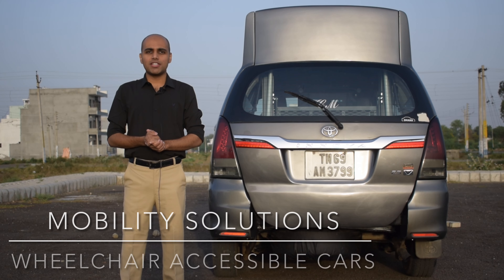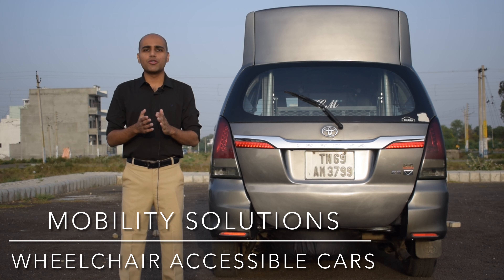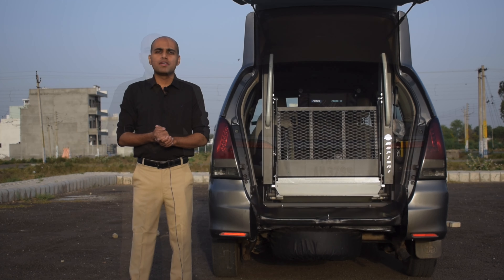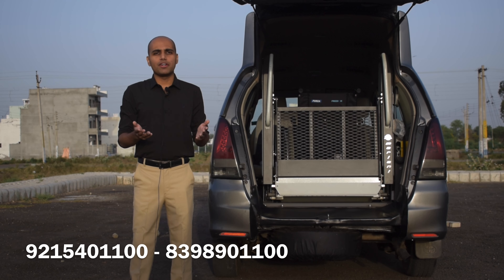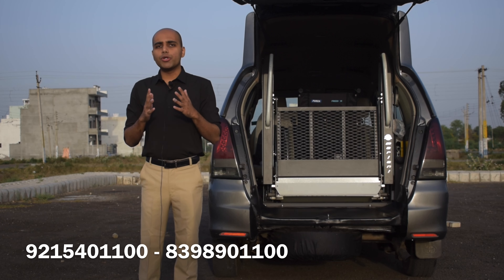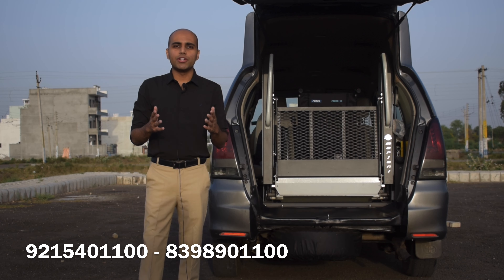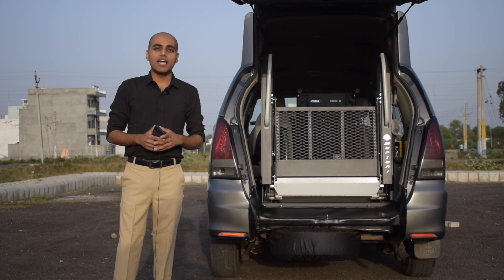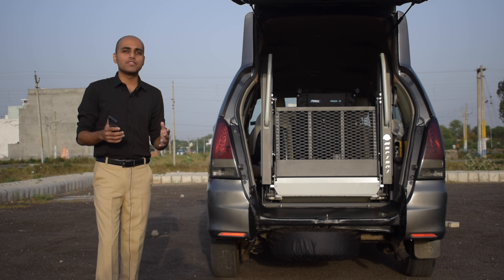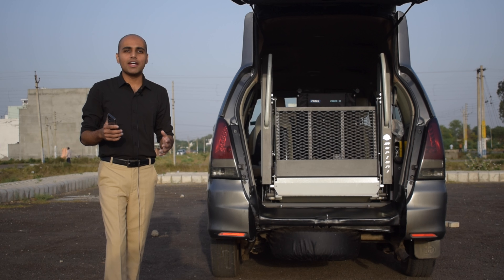Welcome everyone, how are you? This is Sahil Atri from Mobility Solutions and today I'm here with the most awaited video of hydraulic lifts. Hydraulic lifts or automatic ramps that we have installed in this Innova to make this car extremely accessible for wheelchair users. With one of the finest technologies, an imported lift by Mobility Solutions is making lives of persons with disability much easier and independent.